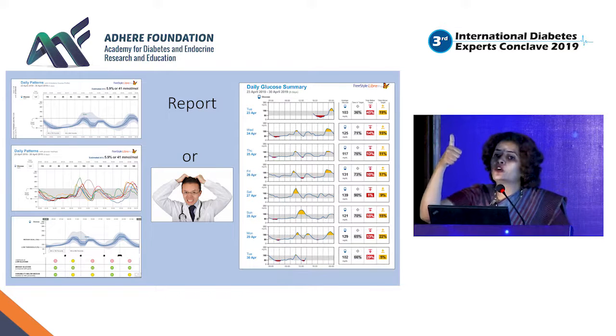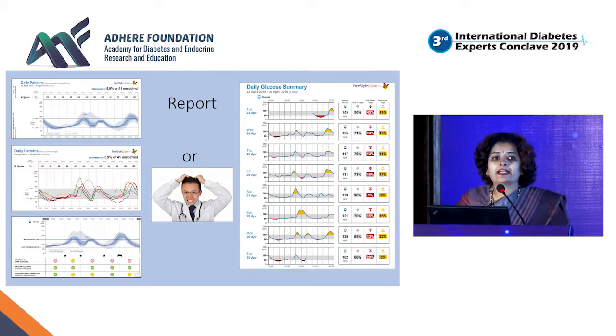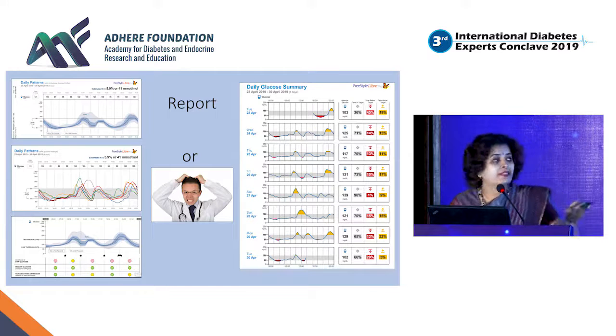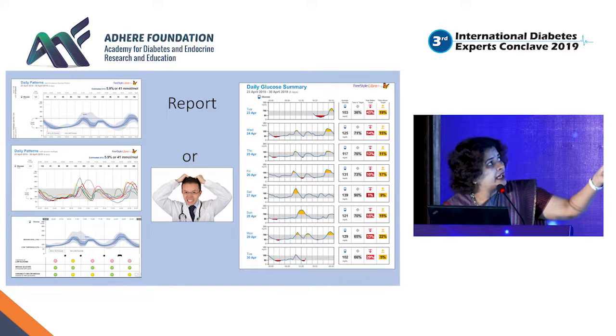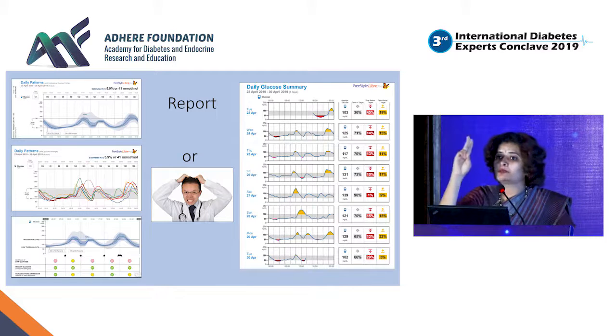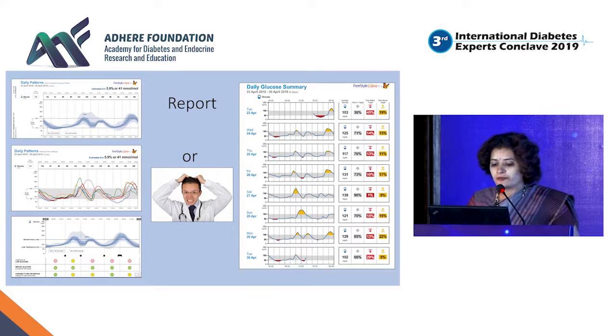This is the diagnostic advantage of using the continuous glucose monitor. I diagnosed that 50% of the time her readings are within normal, but when I go to 90% it is going up and down, and you can see the stability. It is high only at that point. It is not high here, it is not high here, it is high here and it is high here. So these are only 2 points of the day that I understood that the blood glucose is going up, right?